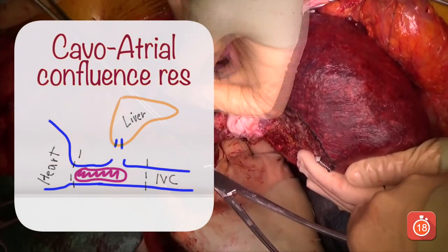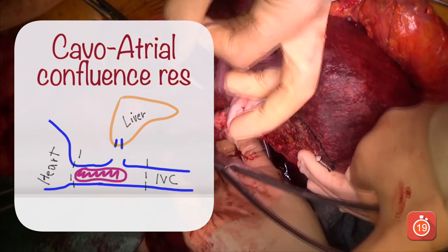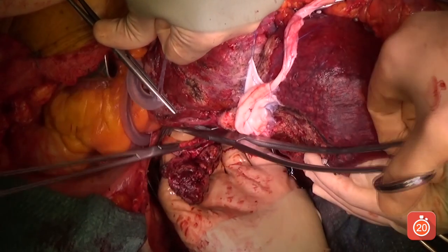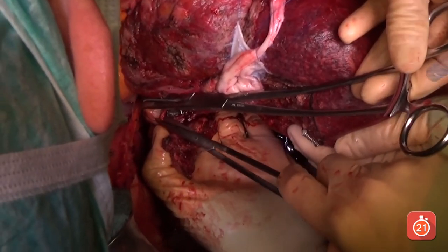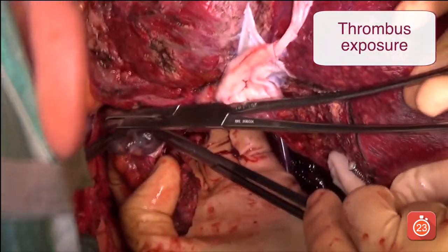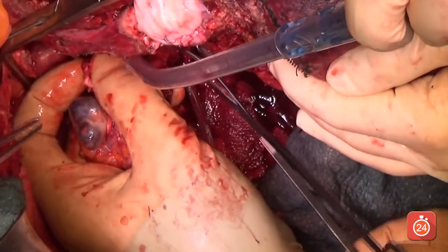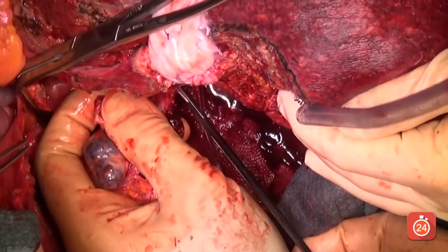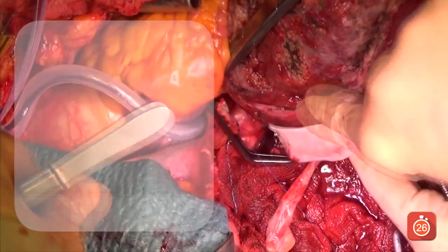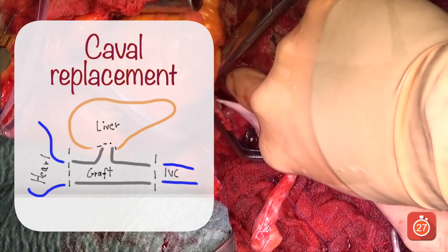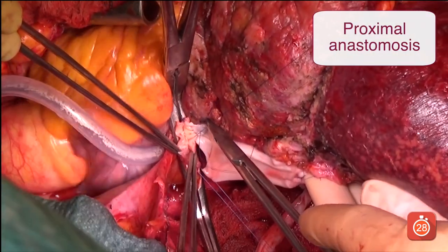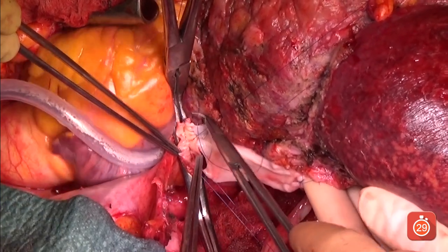In order to remove the metastasis with the caval portion involved, it was necessary to exclude the IVC from the cavo-atrial junction to a few centimeters below the hepatocaval confluence. Visualization of the thrombus permitted section onto healthy tissue under direct visualization. The IVC portion was then removed together with the neoplastic thrombus. The first step in the reconstructive phase was the proximal caval anastomosis, realized with a 4-0 prolene running suture.